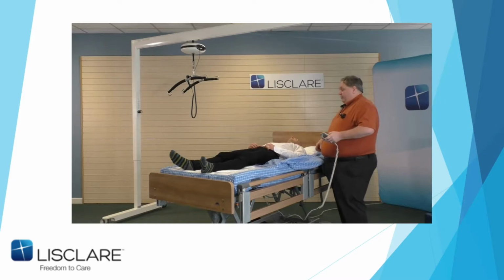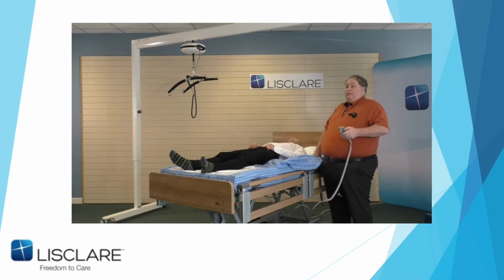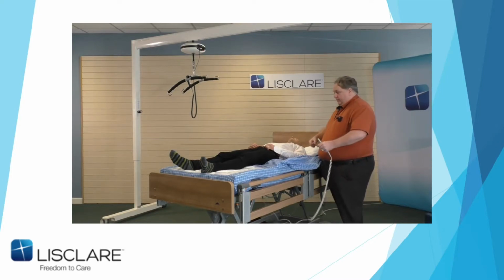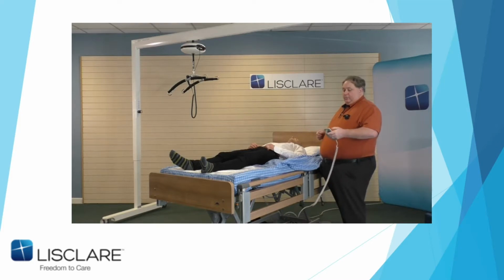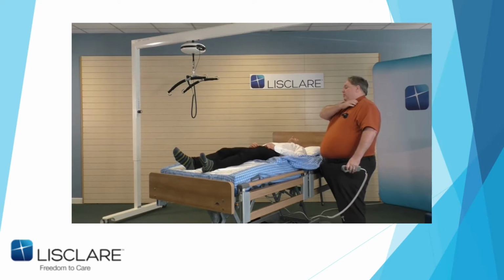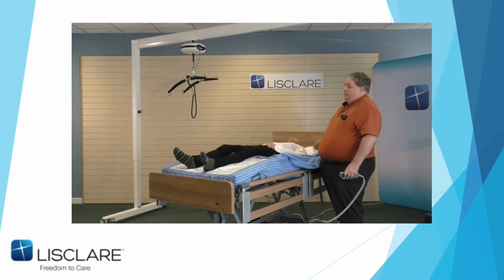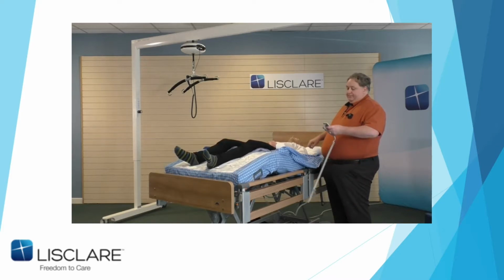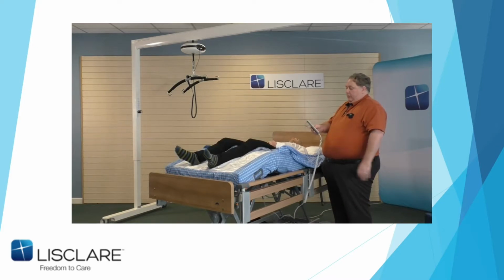So I'm going to show John back up the bed where he is going to be a bit less active. So he can't push up with his left or right leg, and he can't reach out behind him. And again, if there was a team of two carers, it would be slide sheets and ready, steady, slide. But because of this demonstration, I'm on my own. All I'm going to do is lift the legs up, and John's heels are always on the silk. So it removes any friction or shearing on the heels.